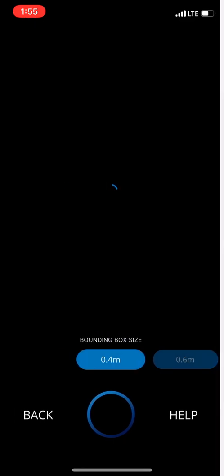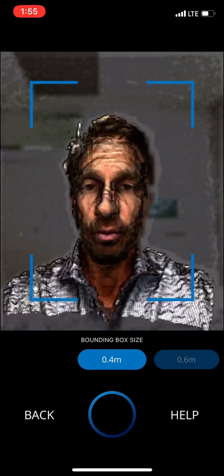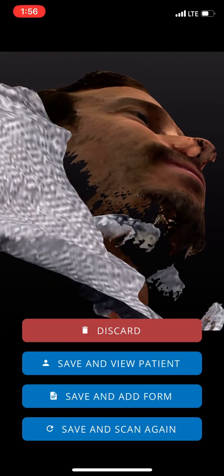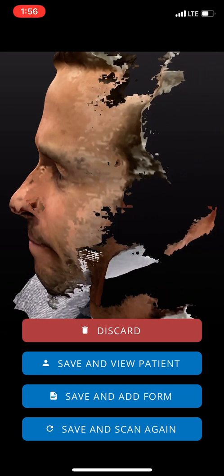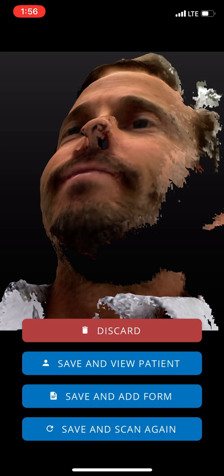Now we're going to do the left orthotic — let's just do my face really quick. I'll do a quick one on my face, moving quickly, then hold still. I moved over to one side and was able to get the nice contour. Try not to be worried about the color — it's the contour and shape we're looking for. If you look at my forehead and nose, you can see it's a really nice shape. Let's go ahead and save this and add a form.